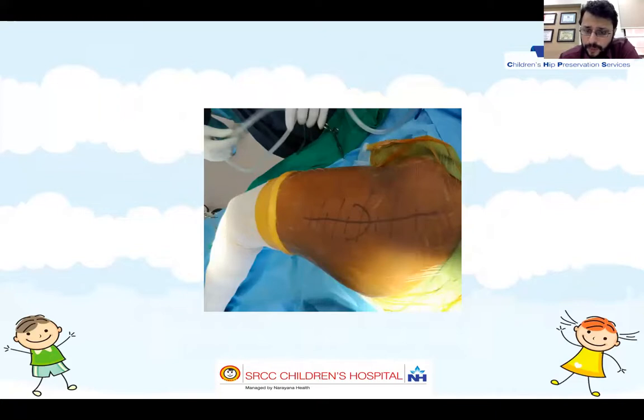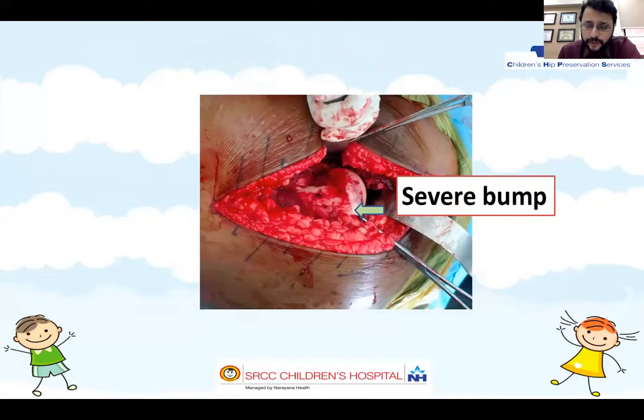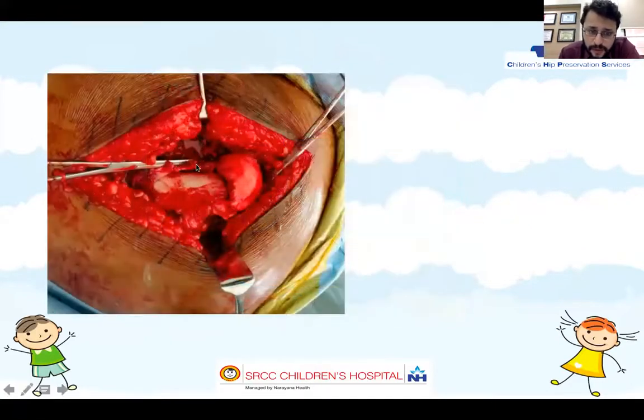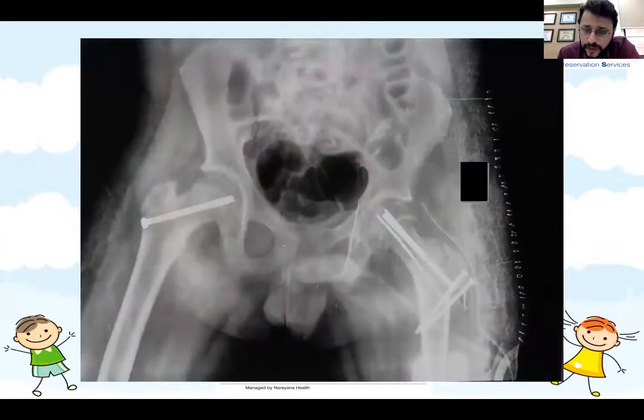So just briefly, a lateral approach, digastric flap. I'm going slightly faster because there's a full video on it. You see that there's this severe bump, which is osteotomized. The retinacular flap is this, which is completely intact, preserving the blood supply to the femoral head. Reduce it, see to it that the head remains bleeding, and then fix it in this manner.